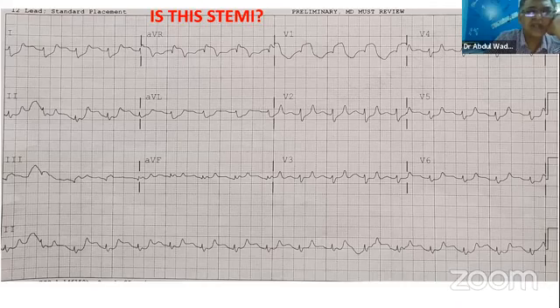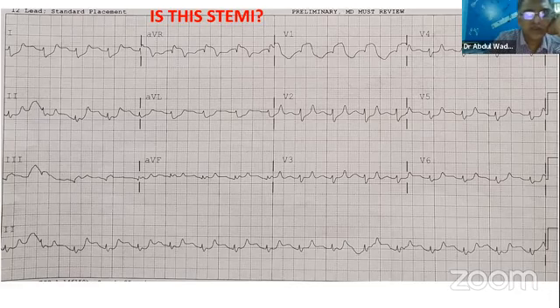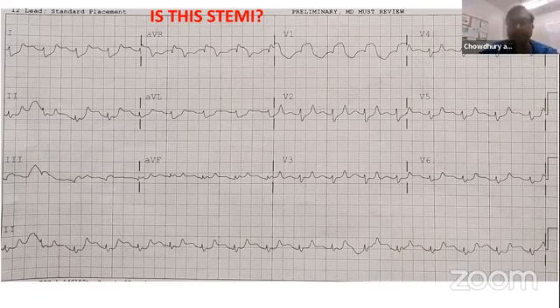Again, the typical ST elevation is only in V1. And in aVR, that's why it is ST depression mostly. aVR is ST elevation as well. So the clinical context will be very important here. This is the thing in the US, some hospitals just call a STEMI and the cath lab staff arrives before you come and then they take it to the cath lab. But I usually say, explain to me why I need to go to the cath lab.